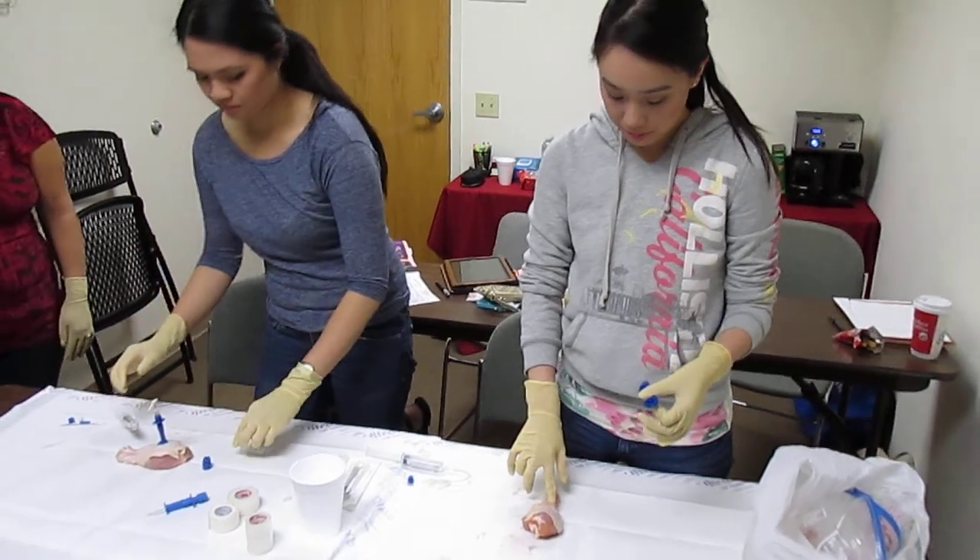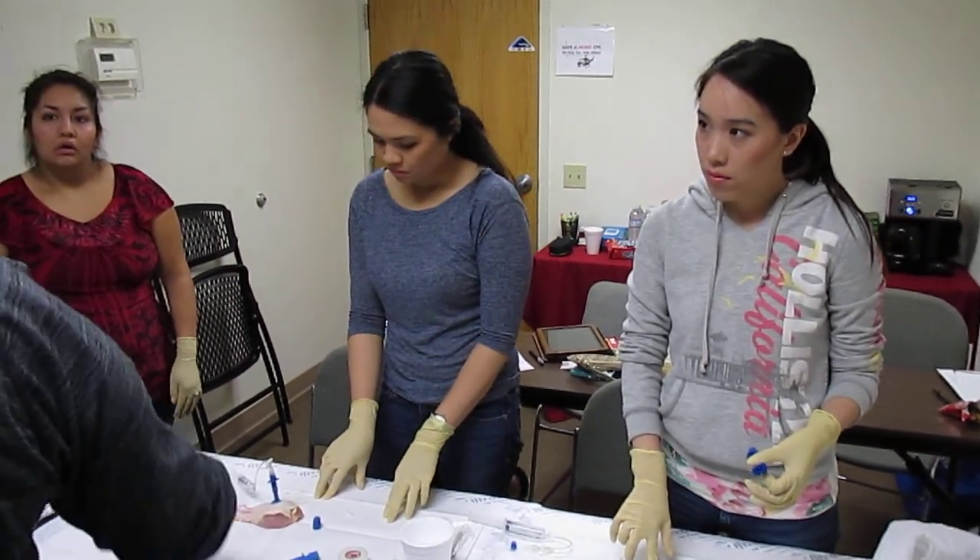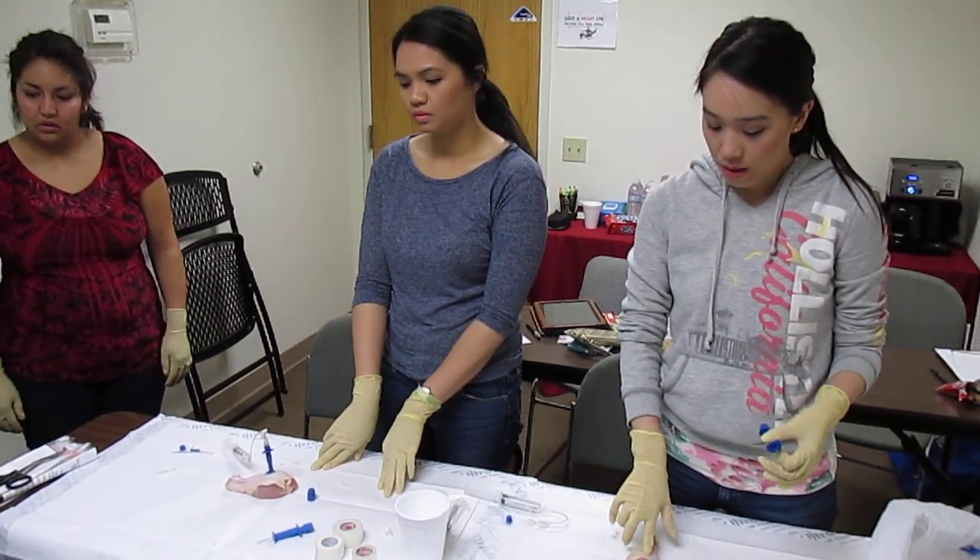And this is just between you and me — any bone that's thick enough to have bone marrow can actually be cannulated, but that's what you have here.